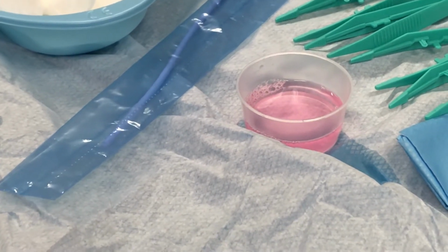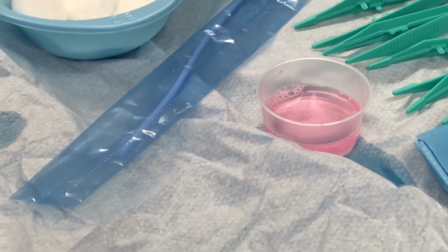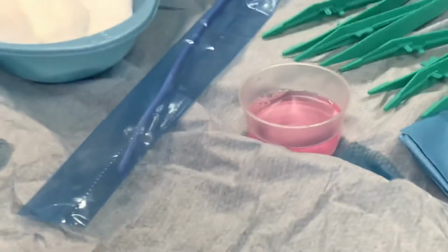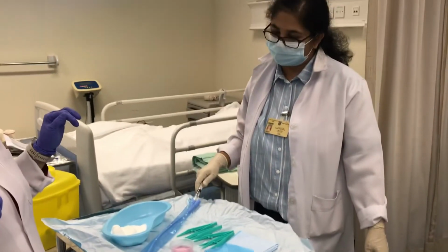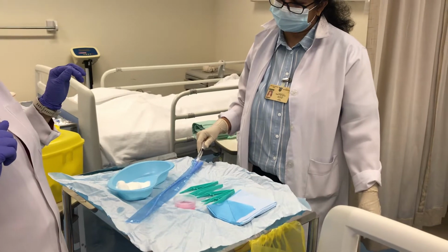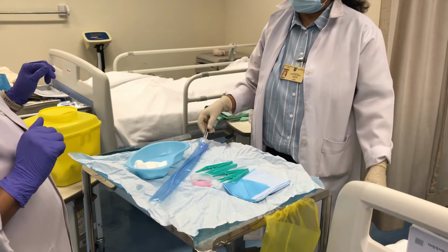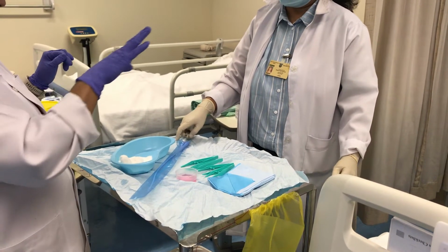You can see the bulb. Can you see the bulb is distending? It's working. Remove it. I will withdraw the balloon. Just to check, you can keep it like this or we'll take it out. No, we'll remove it.